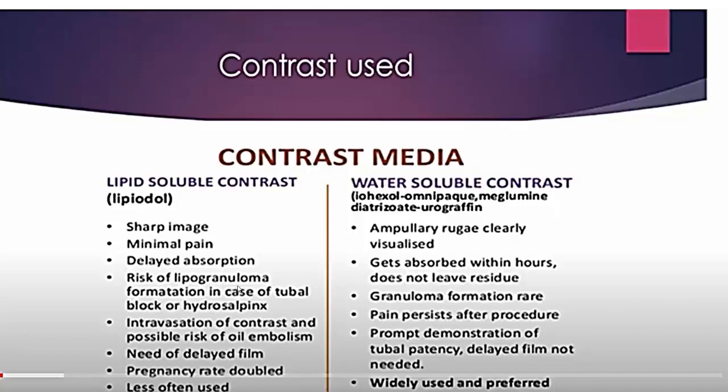There is a risk of lipogranuloma formation in cases of tubal block or hydrosalpinx. With the water-soluble contrast, there is no granuloma formation, or it is rare. Intravasation of contrast with possible risk of oil embolism was a problem. But here the intravasation is not so dramatic, because it is usually just excreted in the kidney, and there is no risk of any oil embolism.